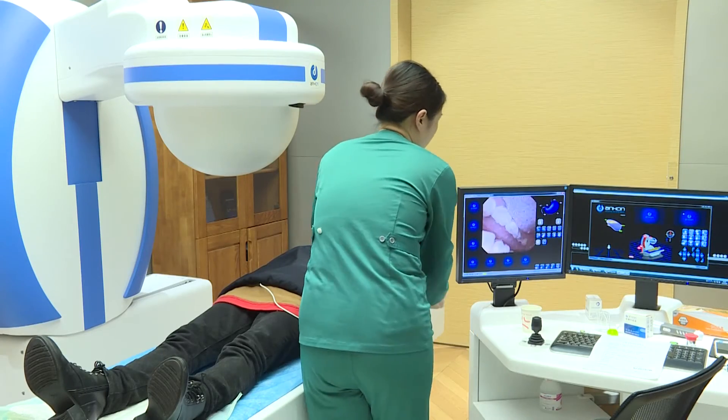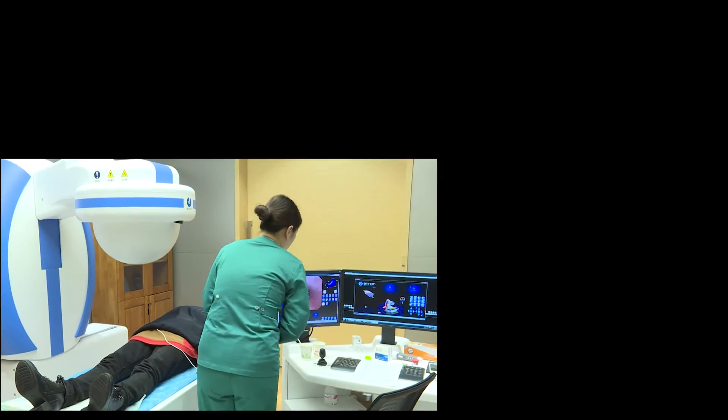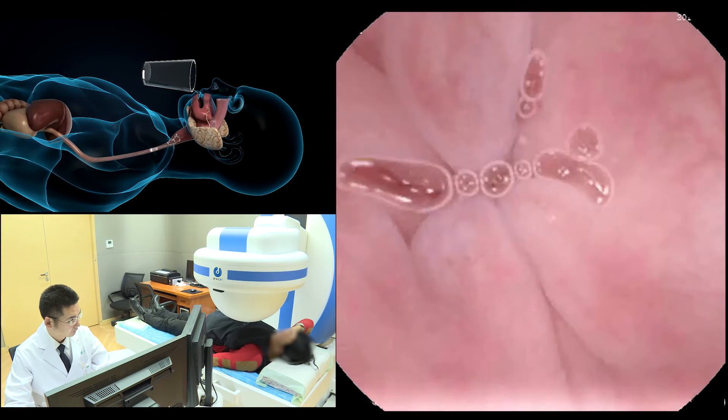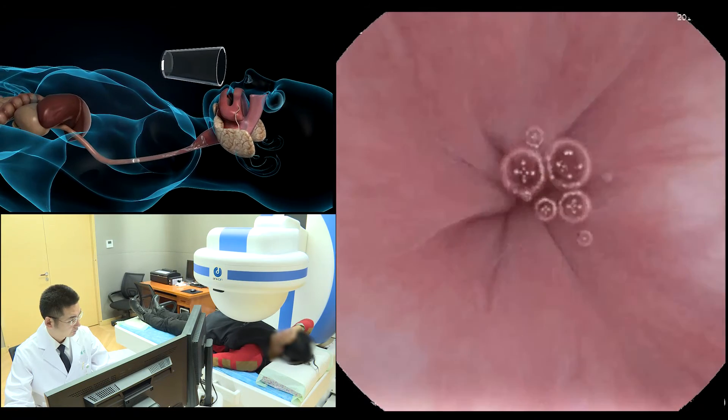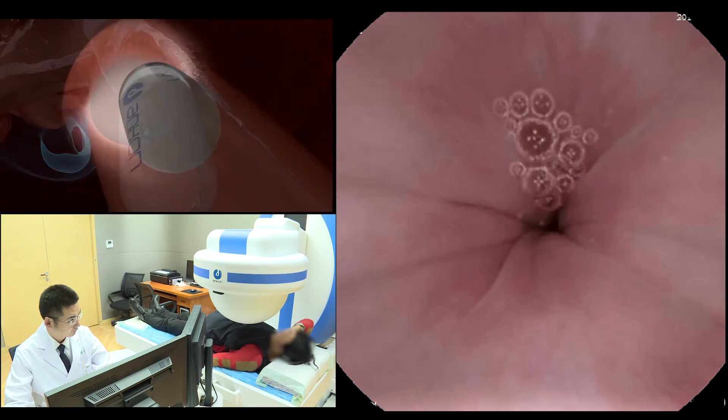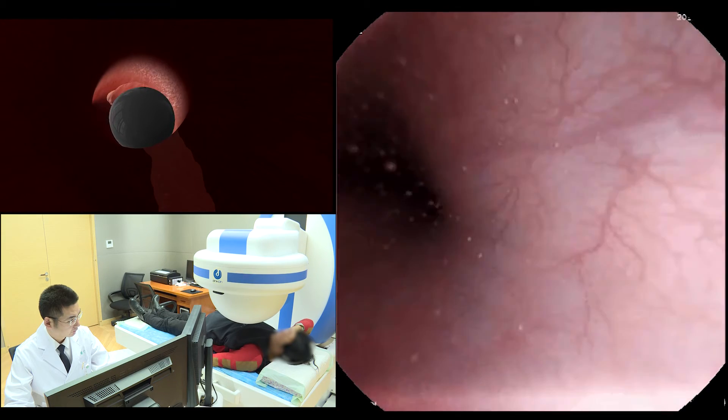The patient was instructed to assume the supine or left lateral decubitus position and swallow the capsule with a small amount of water to effectively observe the esophagus and the dentate line. Images were captured at 2 frames per second.